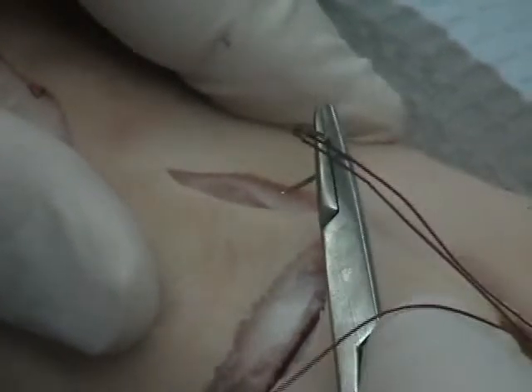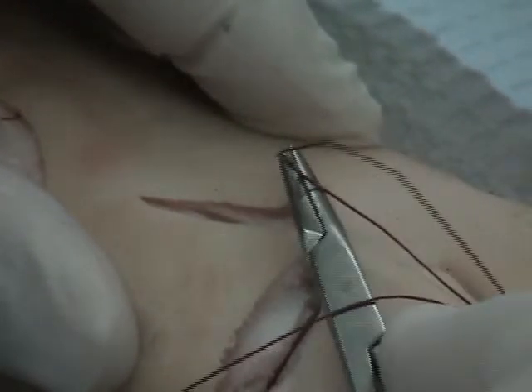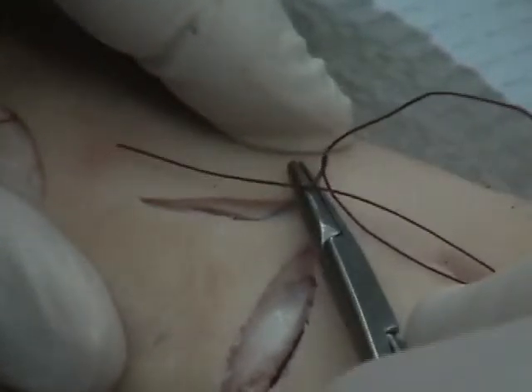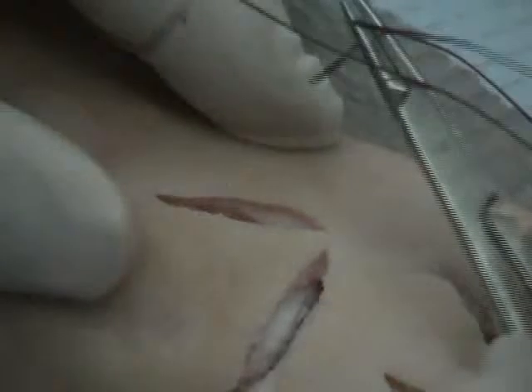With our simple interrupted stitch, what we do is we're going to go down one side, stay outside the hole, and grab tissue on both sides. So I'm down on one side, I'm going to come up the other side, grab tissue on the other side.